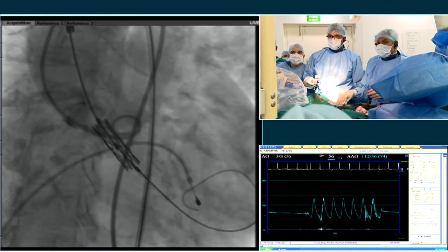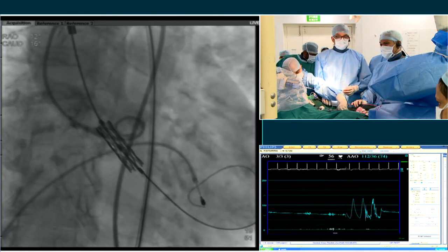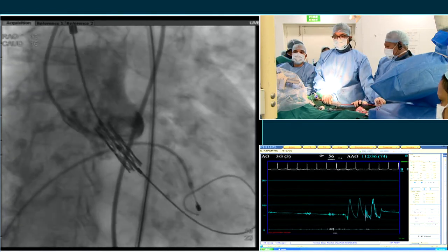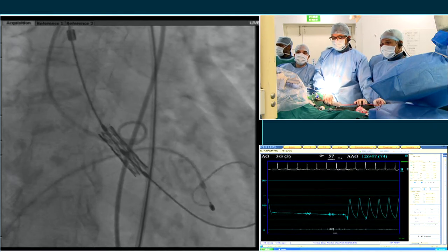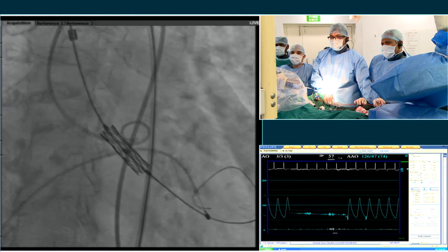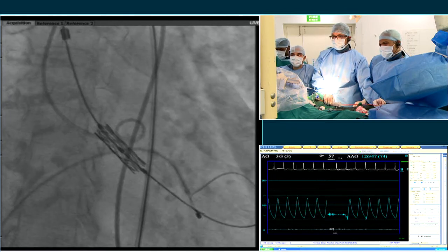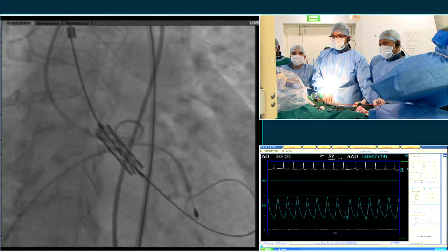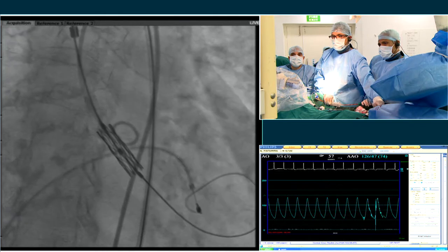So I'm okay with that, because we want to be a high deployment, or you prefer a little bit further in? I think we can be like that. You like that? Okay. What about the panel? What do you guys think? Yeah, I think assuming that that's the central marker, it should be at the annulus. This looks like a good sort of 80-20 implant. Okay. So we'll go here then.